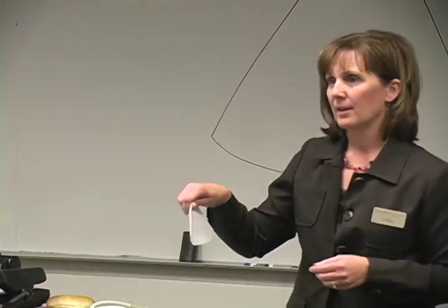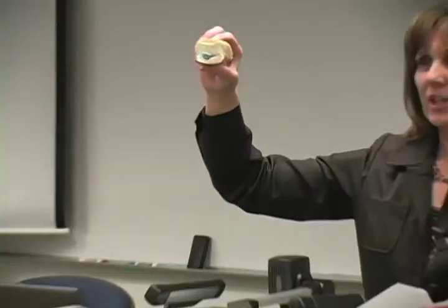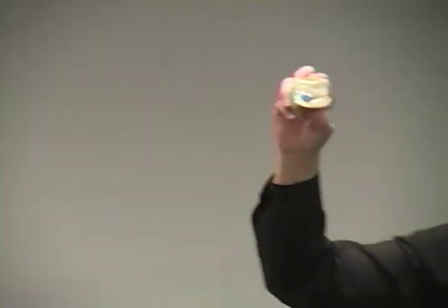So now you see how the aorta is going to look on the ultrasound image. It's going to be long and tubular. Now take it and turn your transducer transverse. And then I'd like you to close your patient up and take the knife and actually cut the bun in half. And then if you look at it, how does the aorta look? Circular, round. And that's how most things look in the transverse cut on ultrasound. They're round.